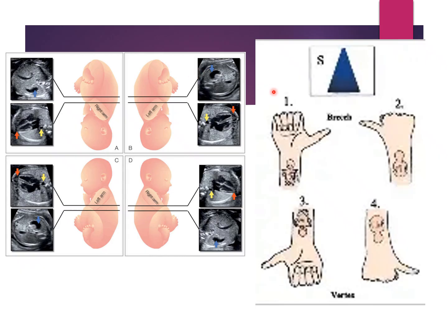There are 3 major ways that I think that you can use. So I'm going to explain all 3 of them, and I'm going to let you figure out which one works best for you. So play the baby. You can physically picture yourself head up, face down, face up, lying inside of a ball and figure out which side is your left and right. Some people really struggle with this because we can't just lay down during an exam, right? We need an easier way to be able to tell what part is up or down without actually leaning forward or laying back.